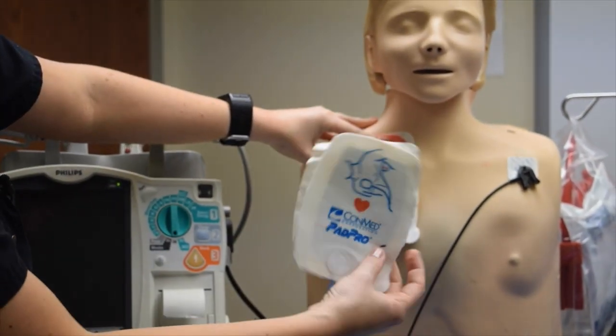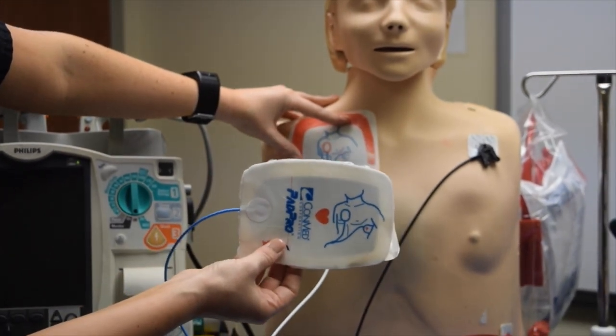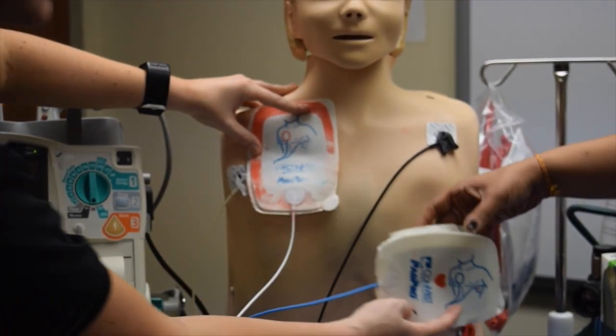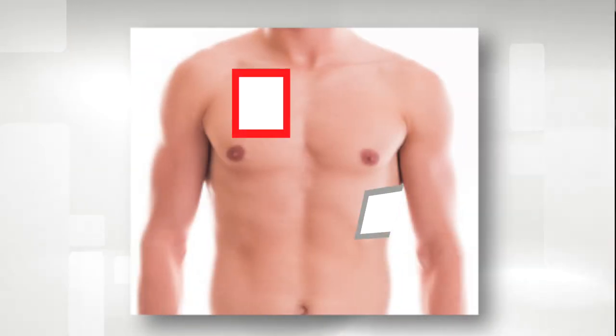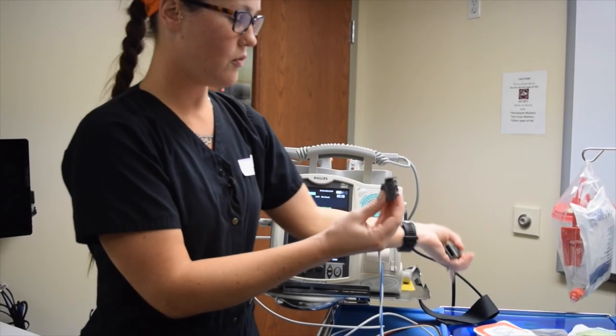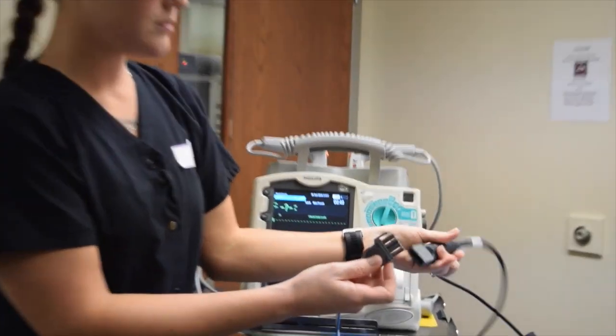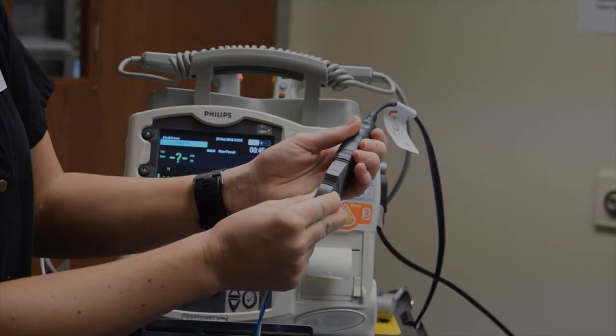Your next pad shows a little heart on there, which would mean it goes on the left side of the chest and around the side over here. That is how you place the hand-off defibrillator pads. Once you get those hooked on, you will get your cable for the pads — these match up with the arrows — and that is how you plug those into the monitor.